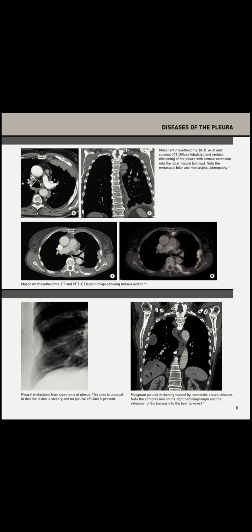It is. It suggests tumor rigidity. And while MRI can sometimes be better for looking at mediastinal or chest wall involvement in detail, the bottom line, radiographically, is that mesothelioma can be really difficult, sometimes impossible, to distinguish from pleural metastases just based on the images. That idea that they can be radiographically indistinguishable is quite sobering. Does that mean imaging sort of fails us there, or does it just narrow the field, pushing us harder towards other tools like biopsy?